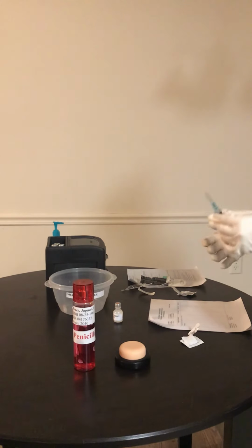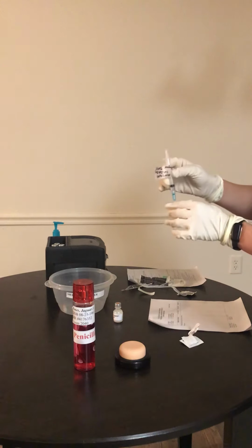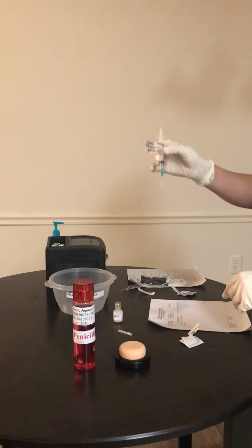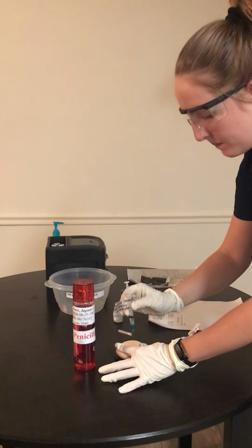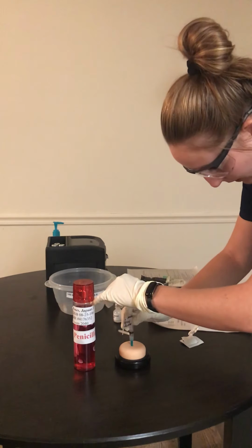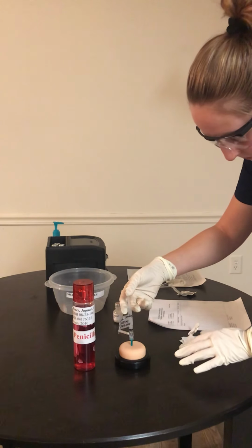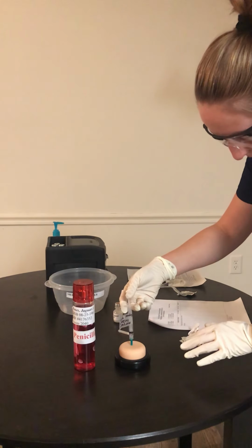Since this is intramuscular and it's in the ventrogluteal, it's going to go at a 90-degree angle. I'm going to remove my cap and place it. I'm going to pull back the skin to make it tight and inject at a 90-degree angle. I'm going to aspirate for any blood return, and there is none. So I'm going to inject it slowly over a 10-second period.